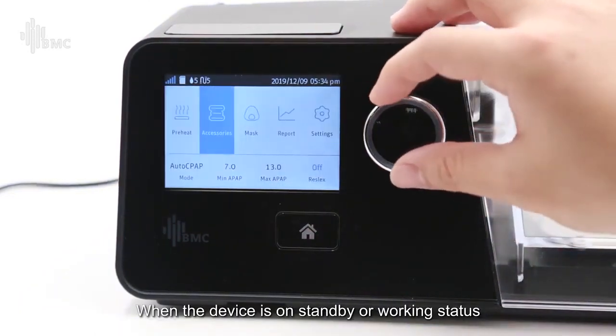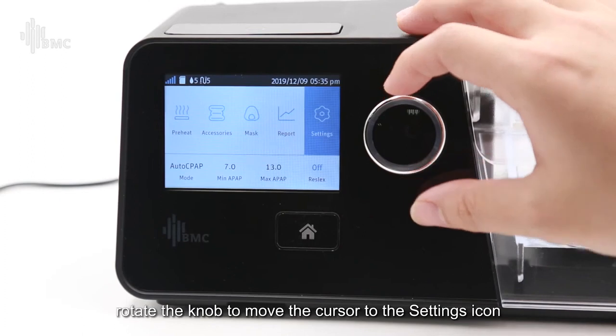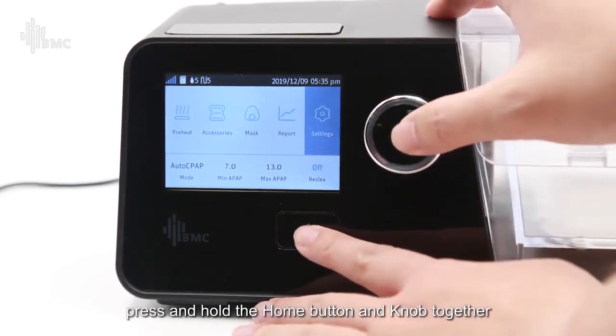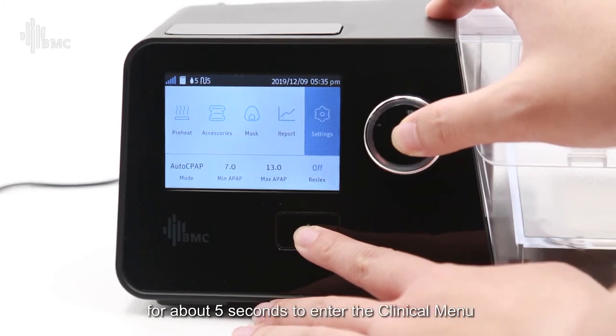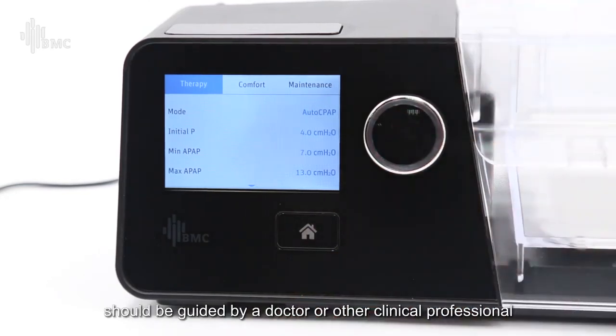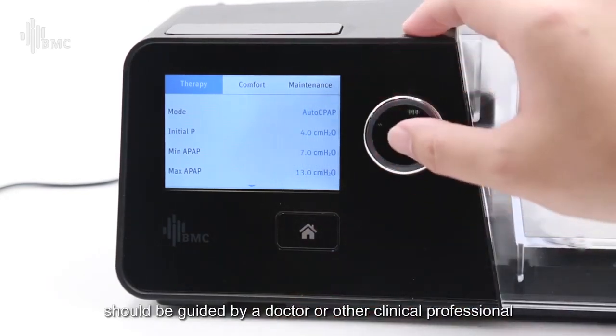When the device is on standby or working status, rotate the knob to move the cursor to the settings icon. Press and hold the Home button and knob together for about 5 seconds to enter the clinical menu. Please note that the settings of the clinical parameters should be guided by a doctor or other clinical professional.